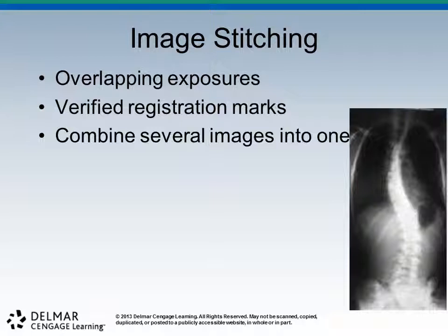And some of them may even do two exposures, like a chest x-ray level and then an upright abdomen level. So you might be able to do this with just two. But we combine those images. It's neat. We have a scoliosis cassette, and I think I've popped it open and showed it to you guys before. It's in our lab. It's a film cassette. And if I didn't do that, ask me about it, and I will. But I'll tell you, we've got different speed screens up here because it's a film cassette. Slower up here, faster down here for the exact same reason. The computer will stitch it together for you now, and it's awesome.